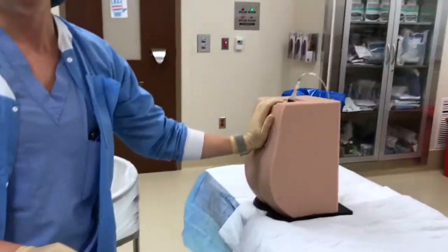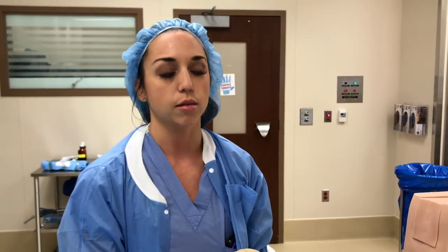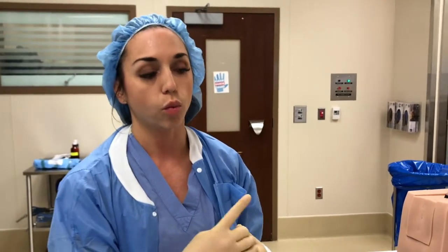All right, and then at that time you would set the patient down and attach your EKG leads, turn your blood pressure cuff to 1 minute cycling, and monitor for hypotension. I also just want to briefly touch on the signs and symptoms of a high spinal, since that is one of the more serious consequences of a spinal injection. So once you lay your patient down, again, cycle your blood pressure cuff in 1 minute cycling. Sometimes tachycardia shows up before the hypotension, so be alert for a brisk tachycardia, which may indicate that the hypotension is soon to follow.